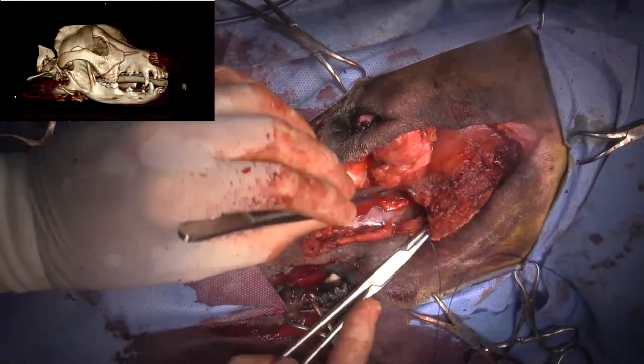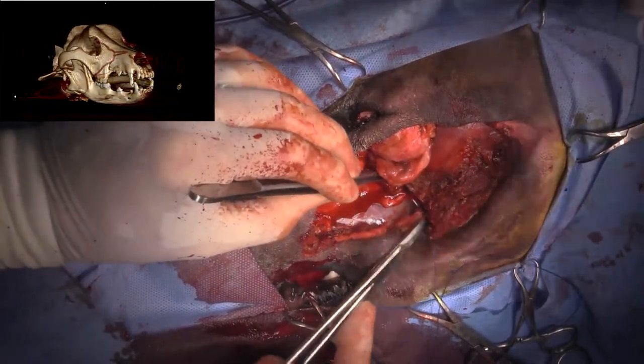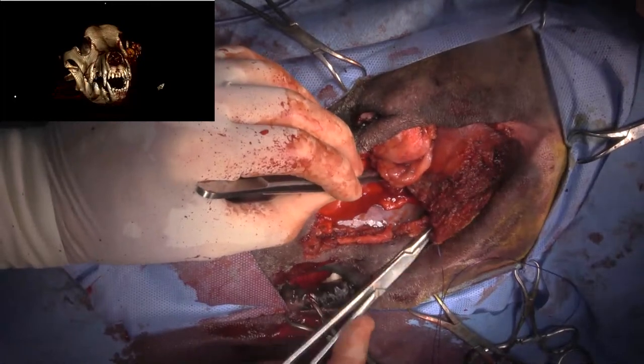I like to close these from the inside because then you don't have knots inside the mouth.